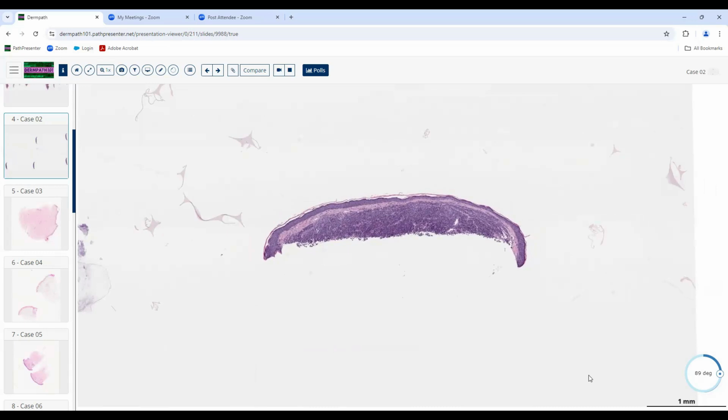So here we got a shaved biopsy, neoplastic process, and the process is located in the dermis. It seems to be, we don't have a whole thing, but if you had a little compass and you could kind of draw a little, finish out the arc here, probably was about this big, overall. It's a little small papule. I don't think we're looking at the top of a giant, huge iceberg. It's probably a relatively small lesion. And so given it's probably about that deep, if we really had the entire thing, if they didn't have a punch, it's probably about as deep as it is broad. That's kind of an important finding in something like this.